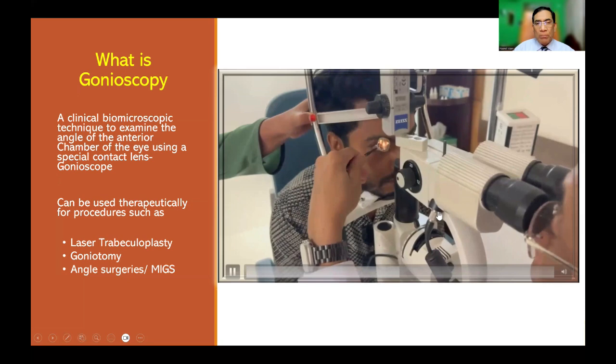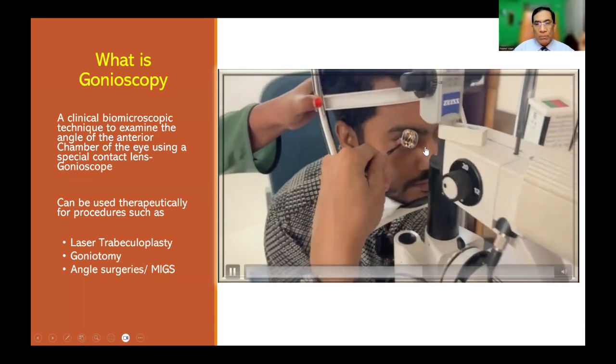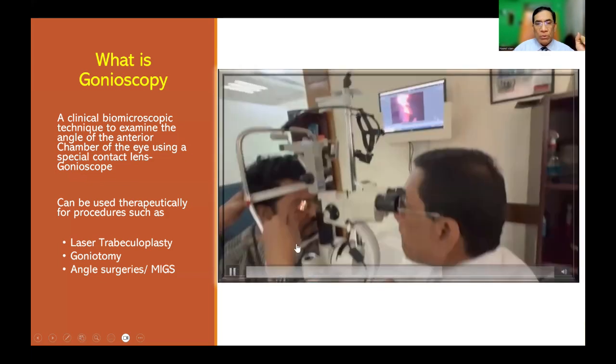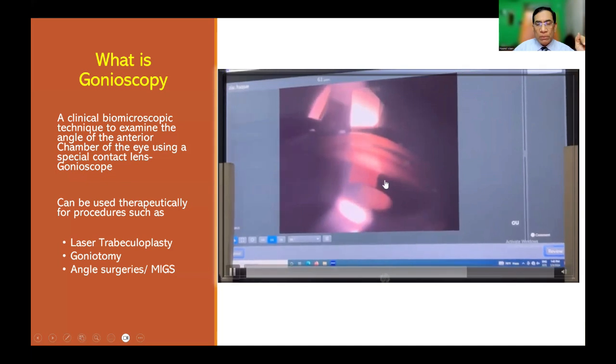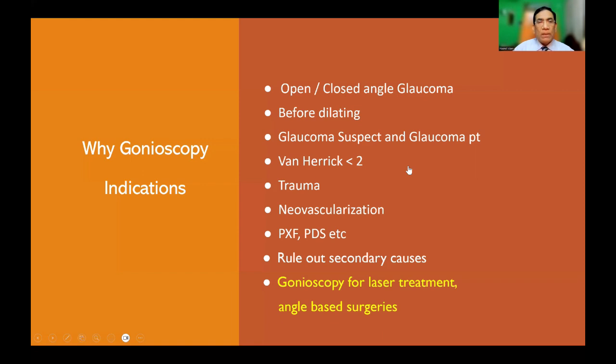So this is a very short 1-minute clinical video that I do in my office every day, many times. First of all, it's very important to hold the lens properly, and you can see in the monitor, you connect to the camera, the angle here. You can show it to your residents and students and other staff.